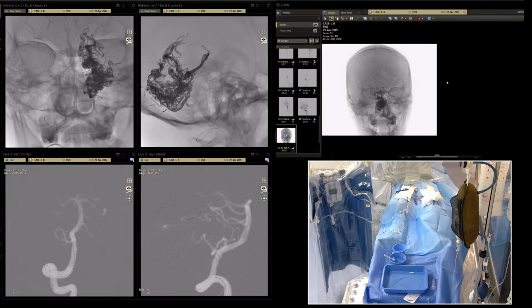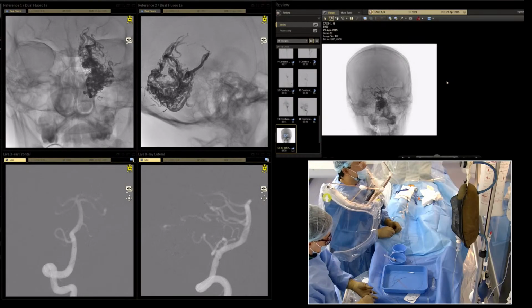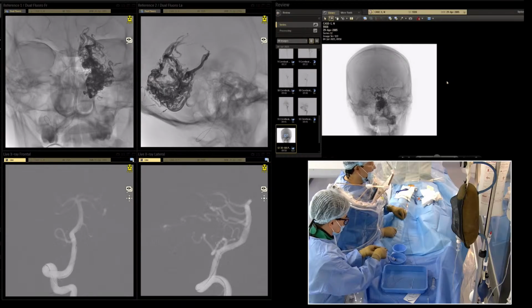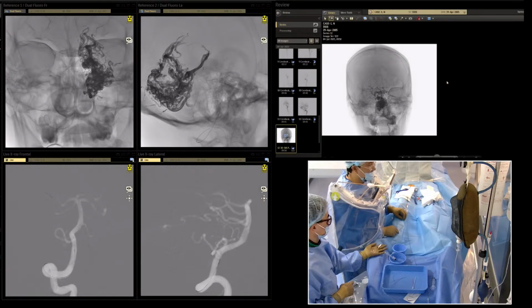Okay, it's enough. It's very important to check the materials before the case starts. It's my practice I learned from my residency, during my full residency in the military medical academy, and from the military teachers I learned that the material part should be enough before you start any kind of intervention.